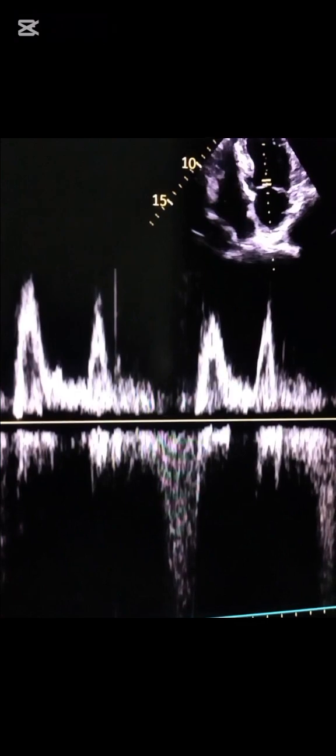For the aortic valve, we expect a shift below the baseline because blood is going away from the transducer — a negative Doppler shift. The advantage is that if you expect a positive Doppler shift normally but also get a negative signal, it means some blood is going away from the transducer, which could indicate regurgitation. Once you know the normal flow pattern — where it should be positive or negative — you can identify what is normal or abnormal. The advantage of pulse Doppler is that it records velocity from a particular site.